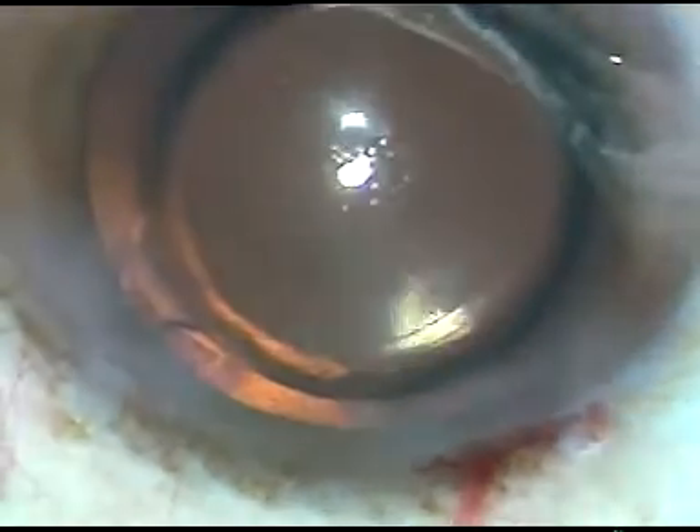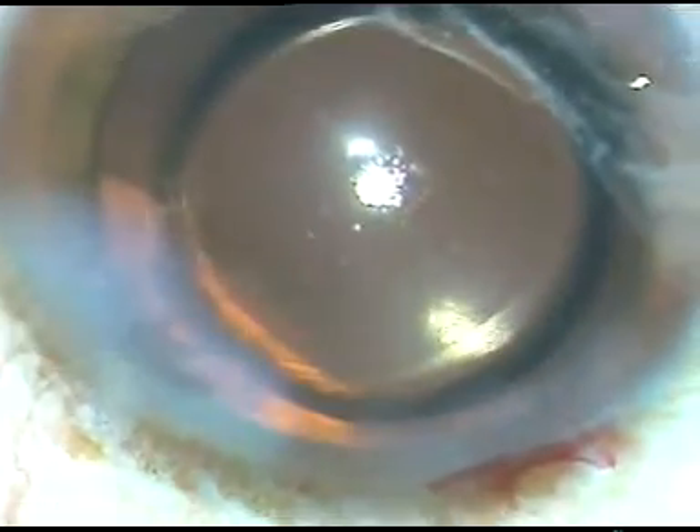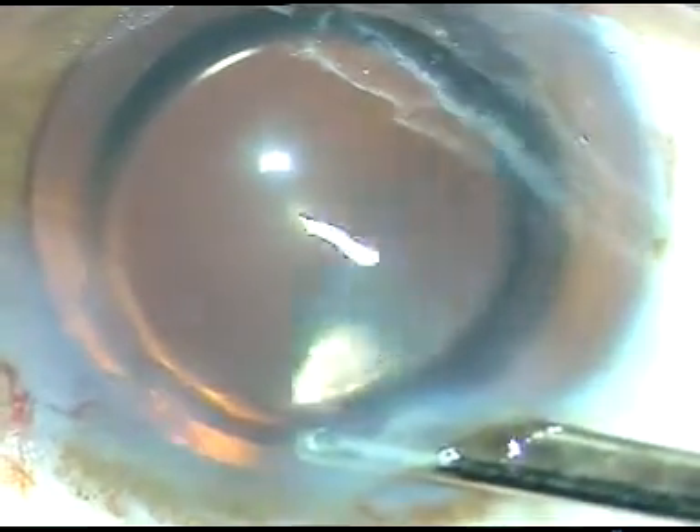There is some leak from the left side port, so I hydrate the side port again. The anterior chamber is washed once more. I am happy that the IOL is in the bag and nicely centered, with no foreign body or cotton fiber in the anterior chamber. Hope this video will help you in your practice. Thank you very much.